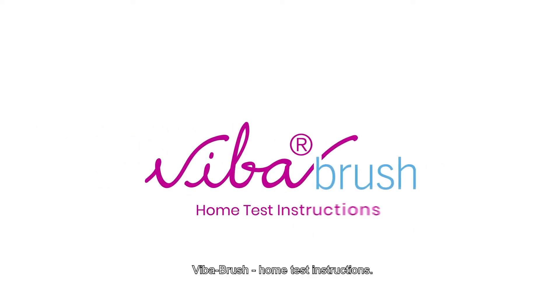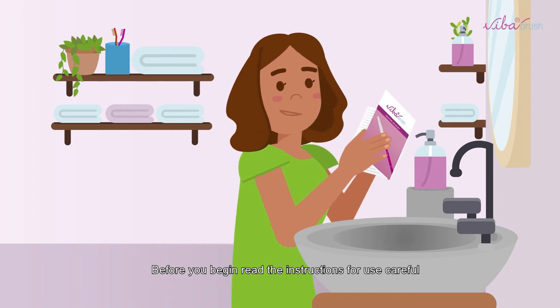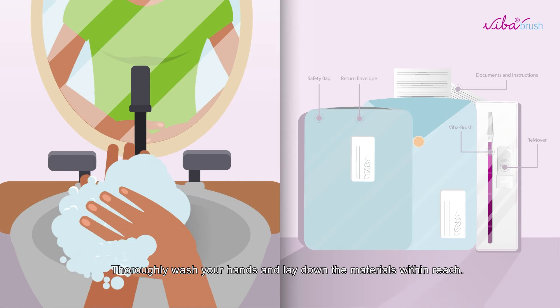Viba-Brush Home Test Instructions. Before you begin, read the instructions for use carefully. Thoroughly wash your hands and lay down the materials within reach.